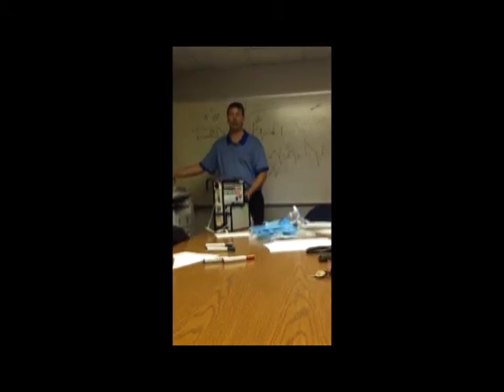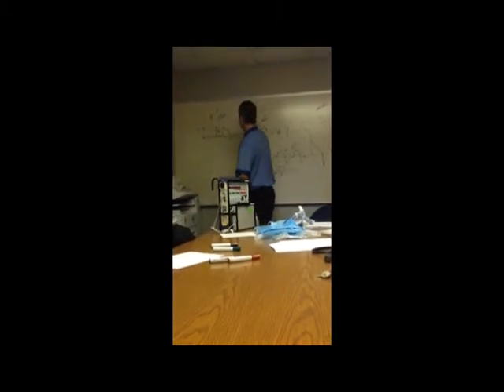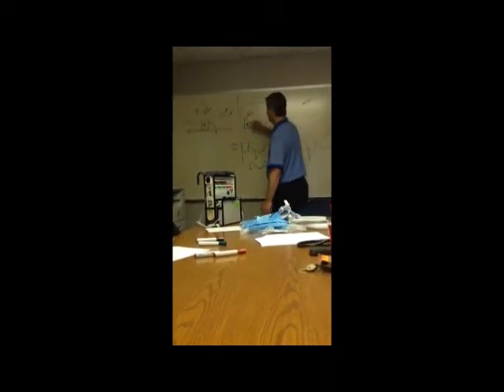We start trying to wean people off BiPAP when they get down to like 10 or 12 over 5. We never drop the EPAP below 5. All right? We just don't. It helps hold the alveoli open. So we leave the EPAP at 5 all the way to when we take them off. So all we're weaning is the support we're giving them. The support is the IPAP. That's what supports each breath. That's what makes the breaths.